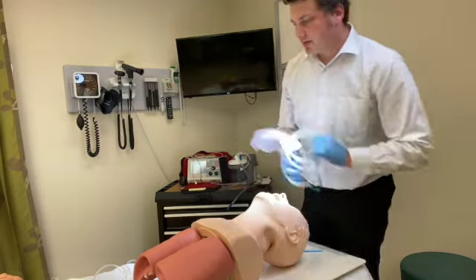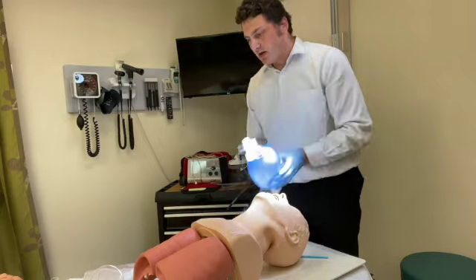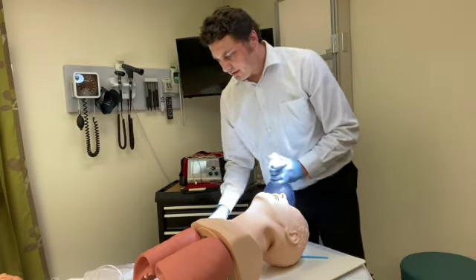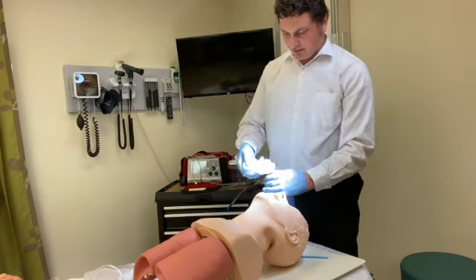Bag valve mask, which is indicated for folks that are unconscious with possible cardiac arrest. So we have our actual cover right here, and there is the actual capnometer, which can be identified right here.